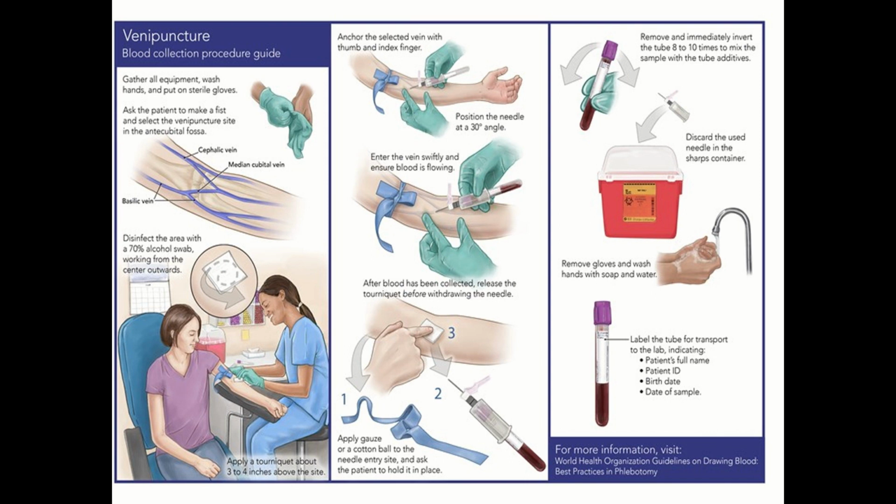Then you discard the used needle in the sharps container. Remove gloves, wash hands with soap and water. Label the tube for transport to the lab, indicating patient's full name, patient's ID, date of birth, date of sample.